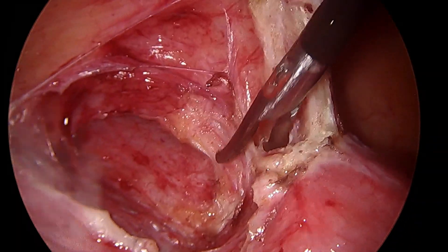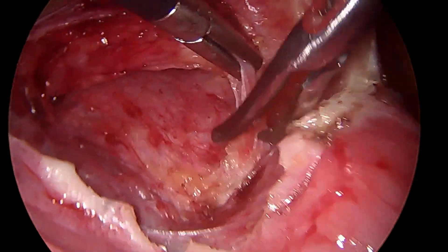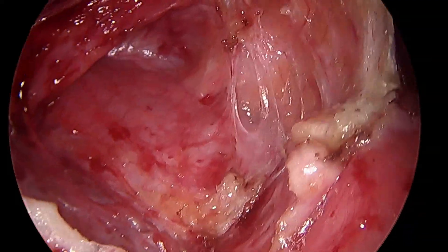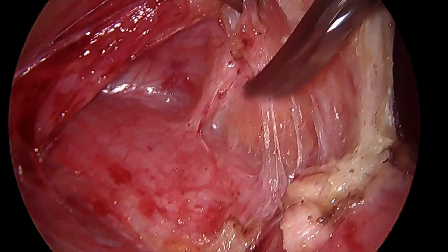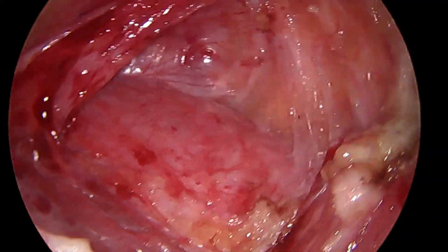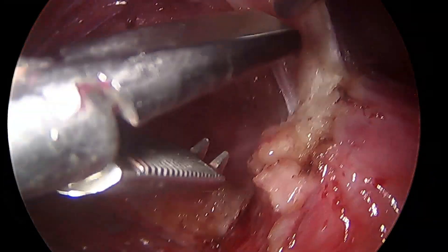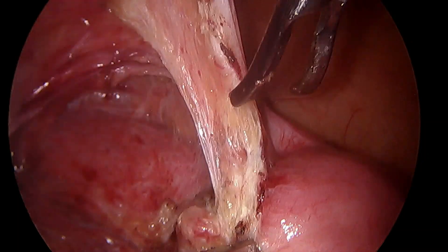And this is the area of separation — or the area where we are going to address these adhesions. The entire level has gone down. Again you will notice this area — this area has the adhesions band. Can you see the fat? The fat means there is no scar.